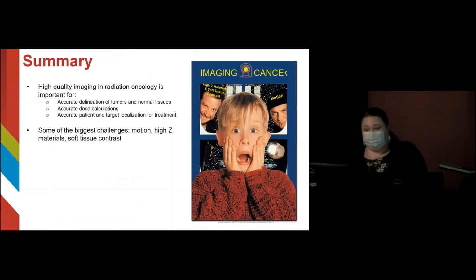All right, so in summary, high quality imaging in radiation therapy is important for the accurate delineation of tumors and normal tissues, accurate dose calculations, and accurate patient and target localization for treatment. Some of our biggest challenges are motion, high-Z materials, and soft tissue contrast.